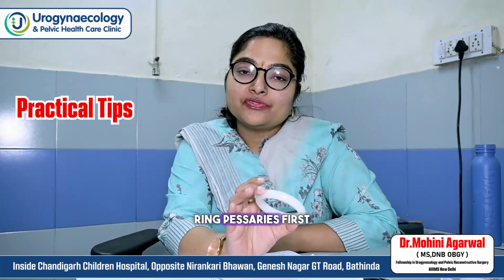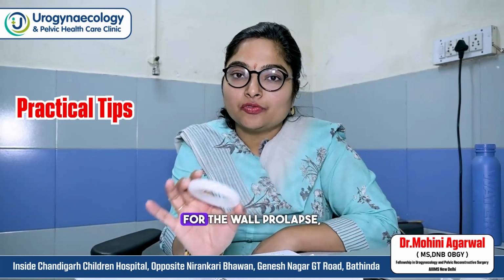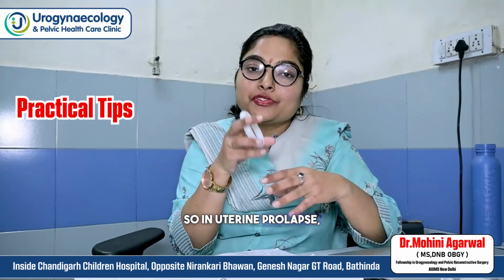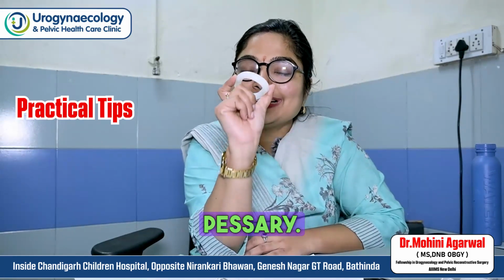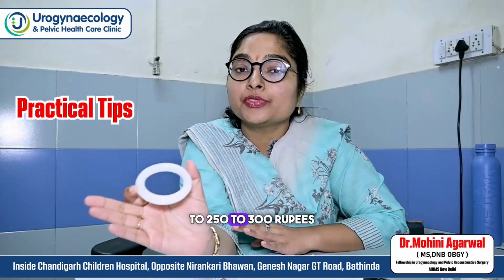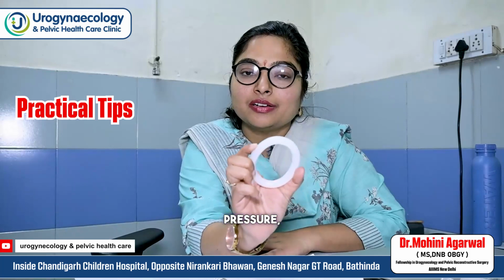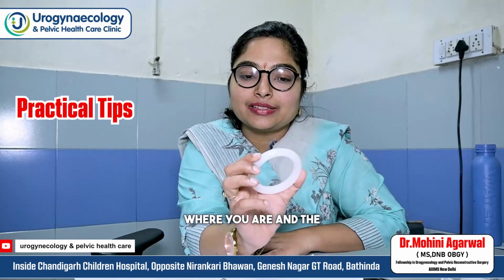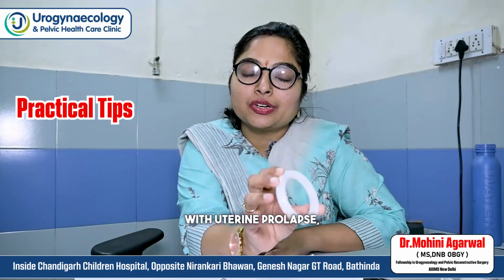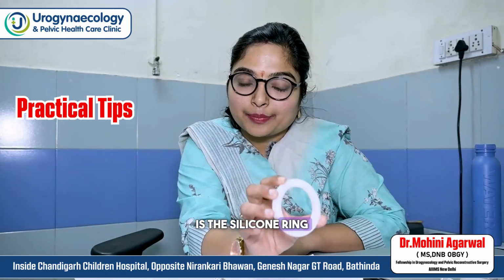Clinical tip: how to decide which pessary. In short, ring pessaries first. We will see it with uterine prolapse and wall prolapse. In uterine prolapse, you first give a trial of the ring pessary. These are silicone ring pessaries, which are very cheap. They range from 100 to 250 to 300 rupees, depending upon the area where you are and the size. So first, with uterine prolapse, you offer the patient the silicone ring pessary.